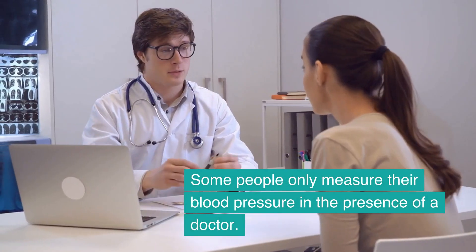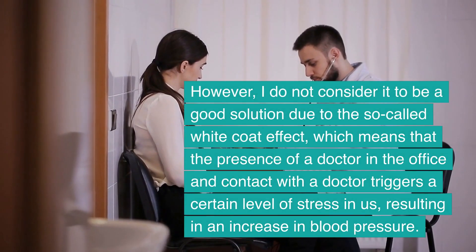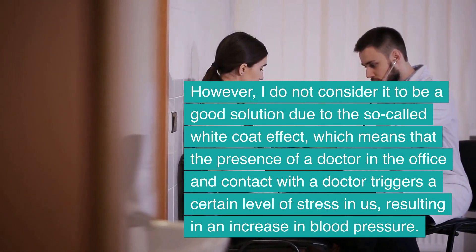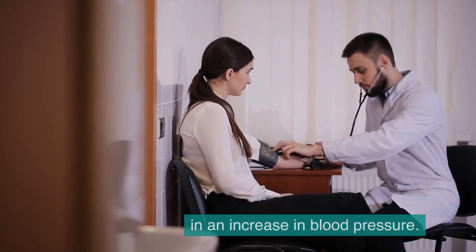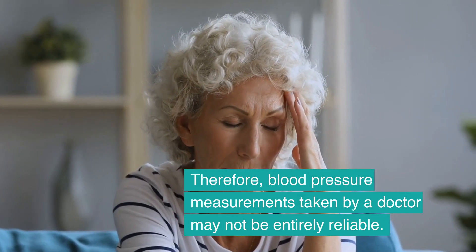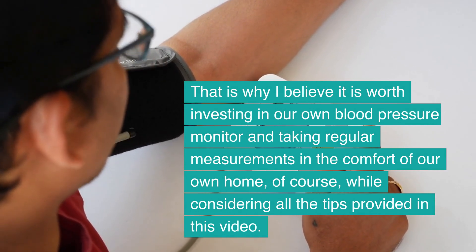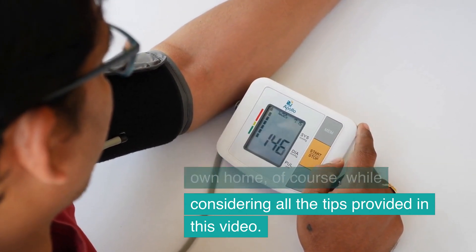Some people only measure their blood pressure in the presence of a doctor. However, I do not consider this a good solution due to the so-called white coat effect, meaning the presence of a doctor triggers a certain level of stress, resulting in an increase in blood pressure. Therefore, blood pressure measurements taken by a doctor may not be entirely reliable, and I believe it is worth investing in your own blood pressure monitor and taking regular measurements in the comfort of your own home, while considering all the tips provided in this video.